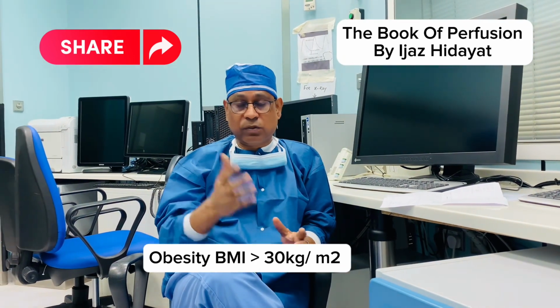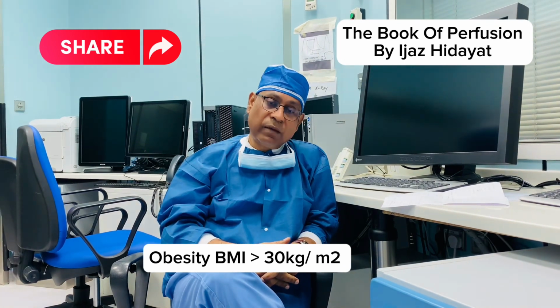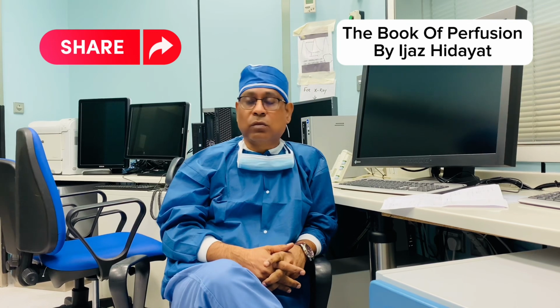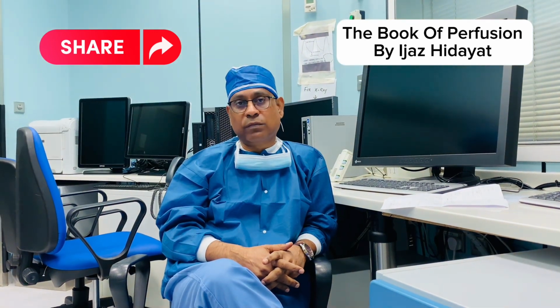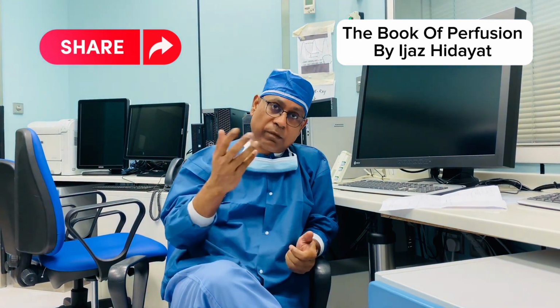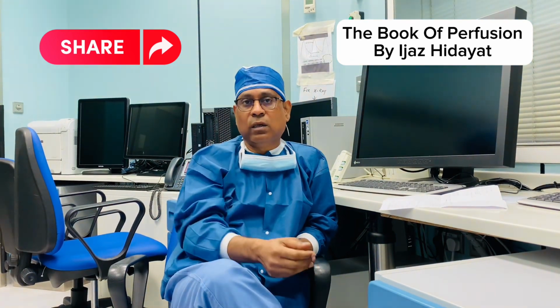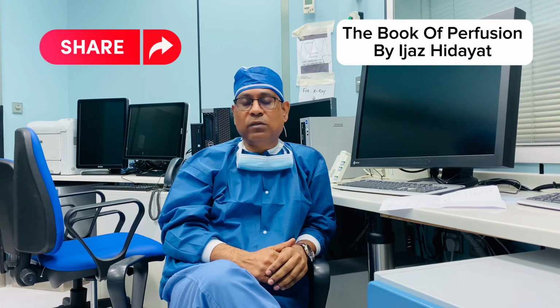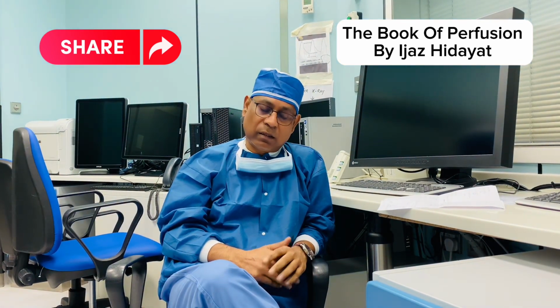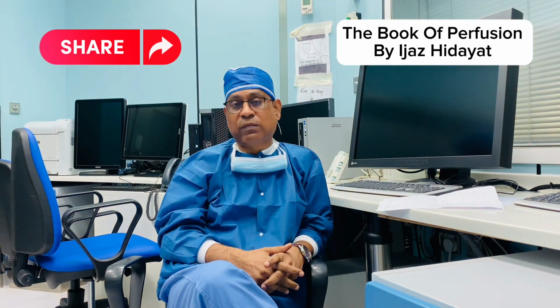So as per your question, if the patient's weight is, for example, 125 kilograms, how are we going to calculate his body surface area and the calculated blood flow? This is your question. For example, your patient is 173 centimeters and the weight is 125 kg.